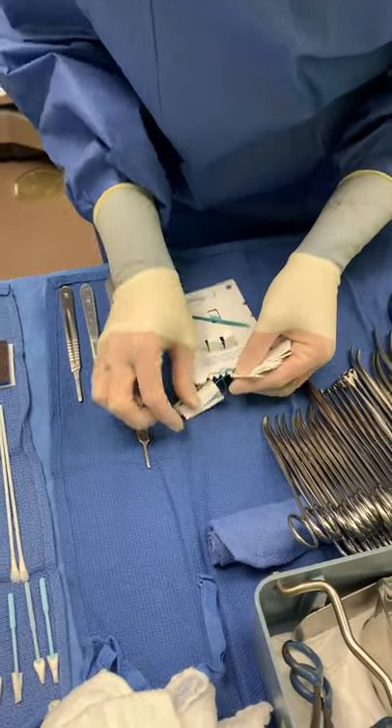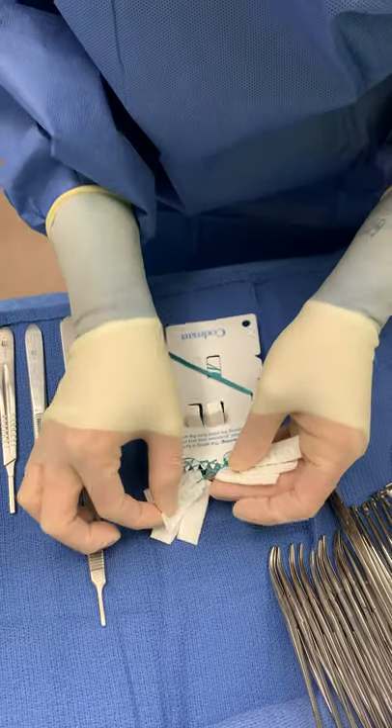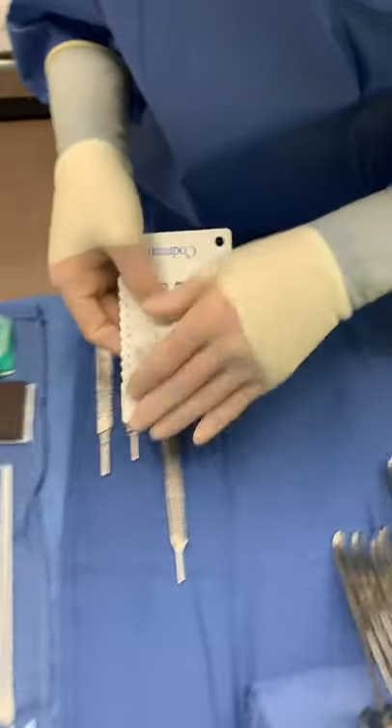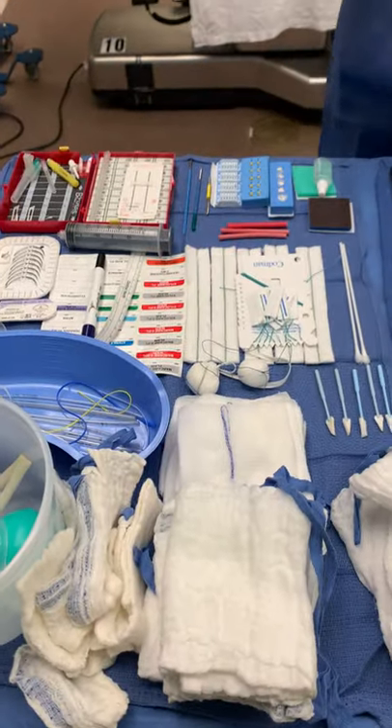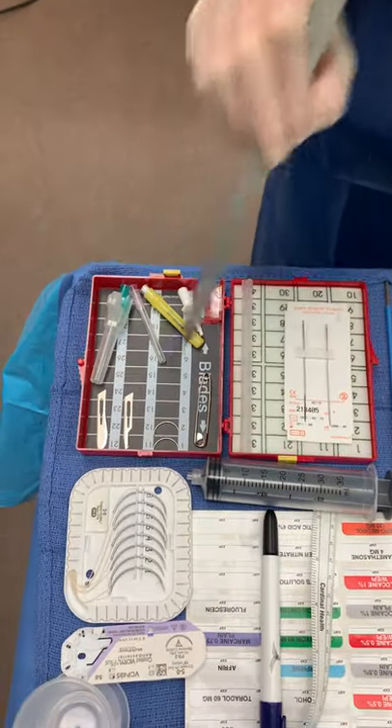Cotton weights continued: 6, 7, 8, 9, 10, 11, 12, 13, 14, 15. Blades, I have 1, 2.